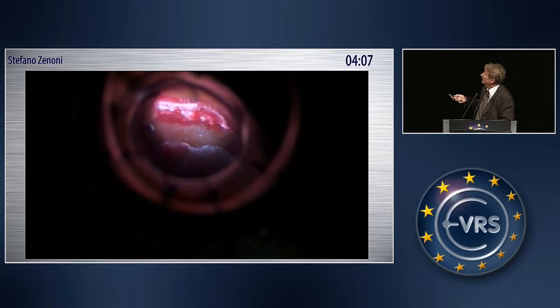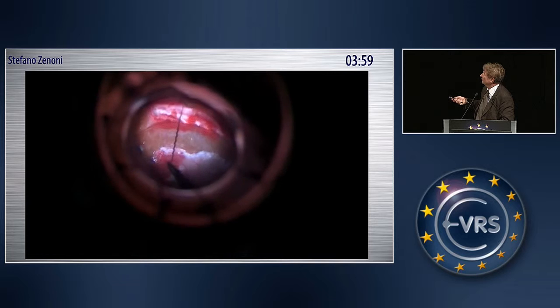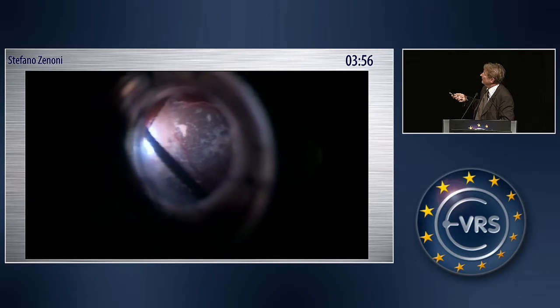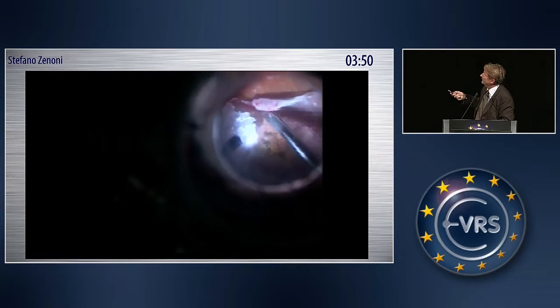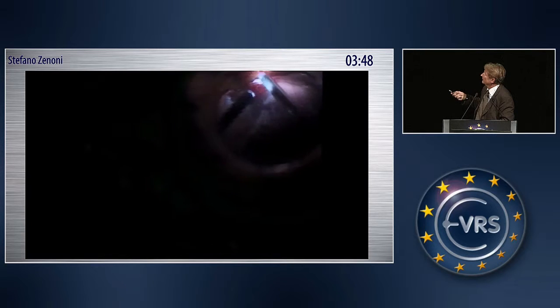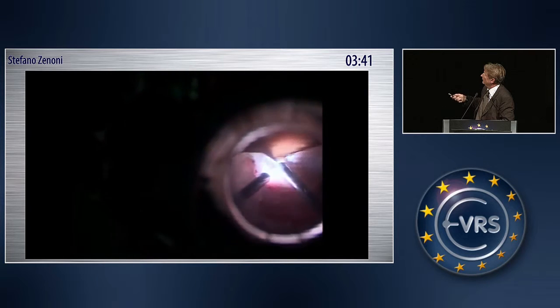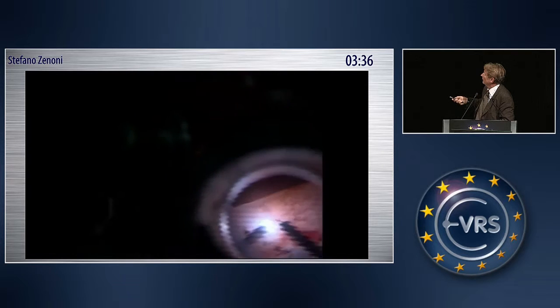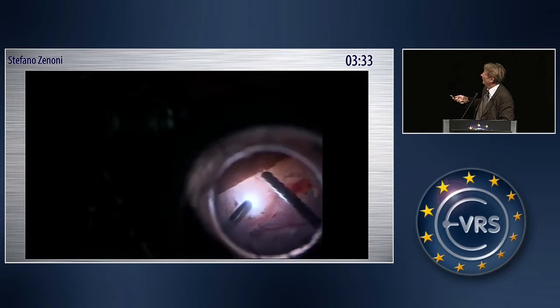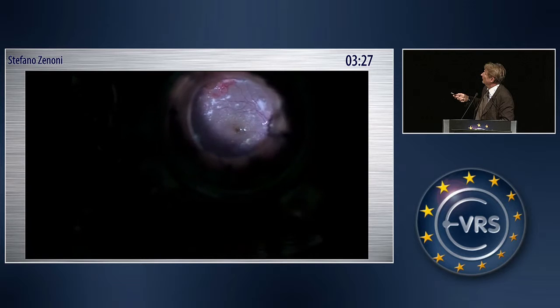And you see the retinotomy we have been obliged to do to permit the retina to recover its normal position. And when we make this kind of retinotomy, we have to stay where the retina is sane, not fibrotic. Otherwise, we will have another reaction on the border of the retinotomy. We also remove all the subretinal membranes, and at the end we put perfluorocarbon.